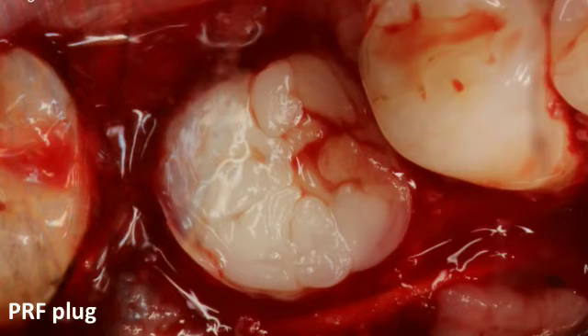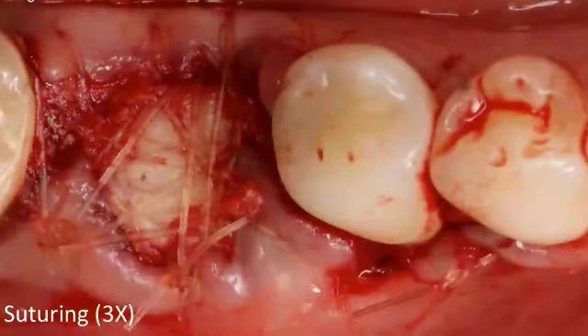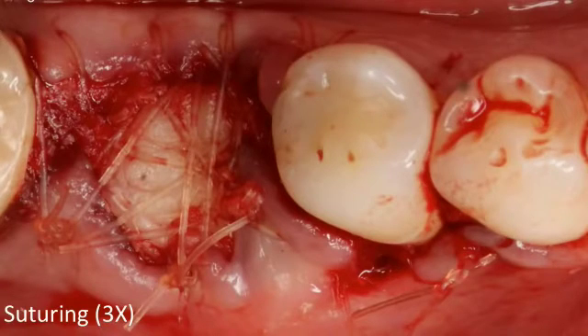Stabilize the plug with gut sutures. I use three separate X-sutures. If you're not familiar with the X-suture, you can look up some of my videos online — they explain it well. Make sure the X-suture is holding the membrane in place and everything is immobilized.